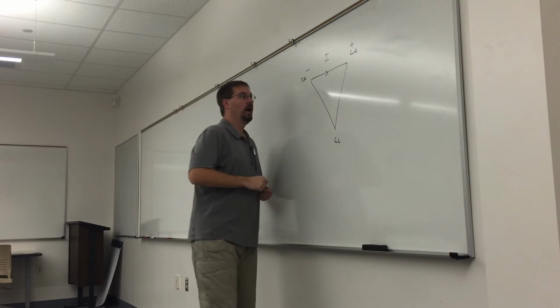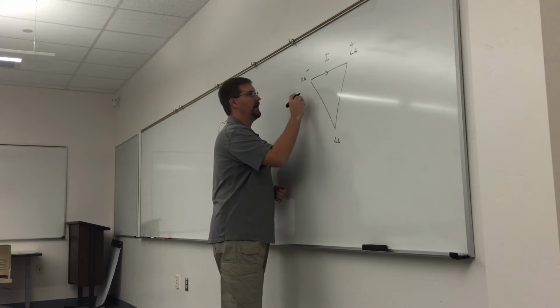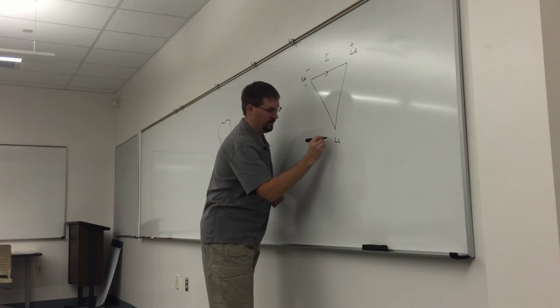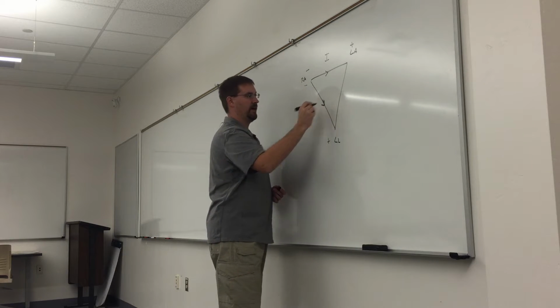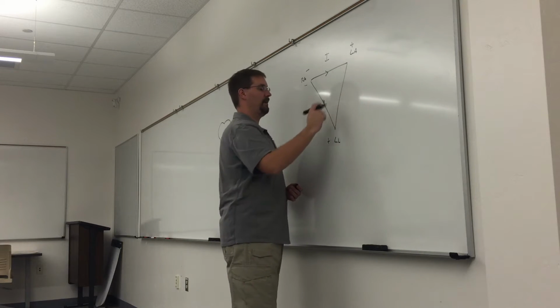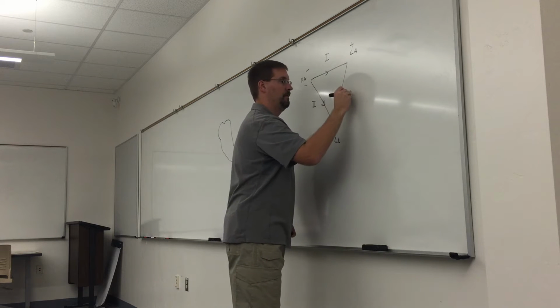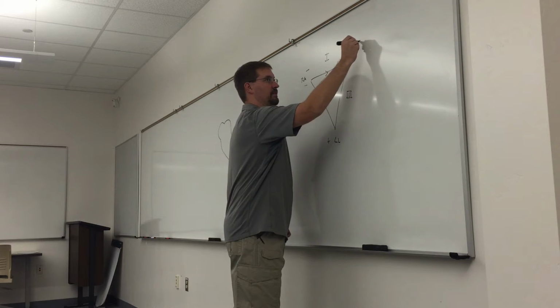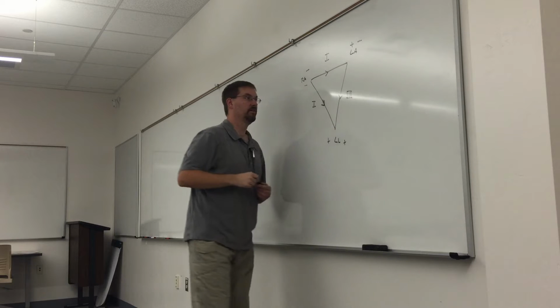All right. What lead is 2, or where is lead 2? Right arm, left leg. All right, and then right arm's negative or positive? Negative. It's negative, positive, and lead 2 looks in that direction there. You guys cool so far? All right, hopefully it's just a review. And how about lead 3? Left arm to left leg. Down. Okay, left arm negative to left leg. So this is negative, and this is positive. It looks in that direction there. You guys cool with that?